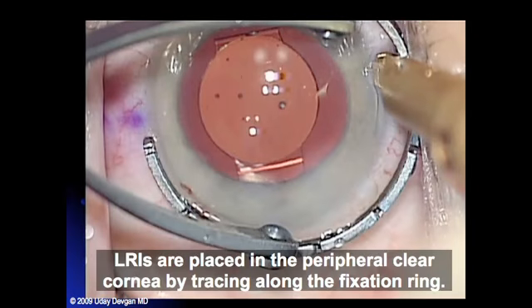And then remember, my LRIs are actually placed in the peripheral clear cornea and not actually at the limbus. Another trick that I do is I actually trace my fixation ring with the diamond blade footplate so that I get a perfect arc every time, so I don't have to freehand it.